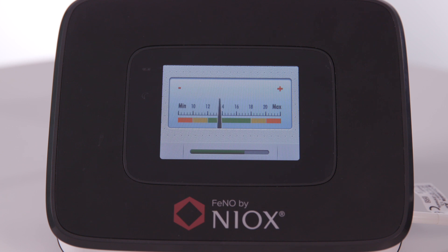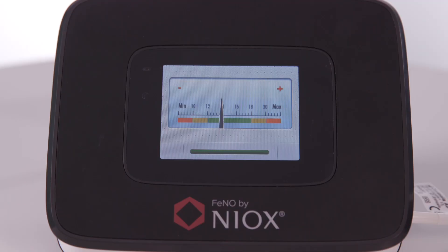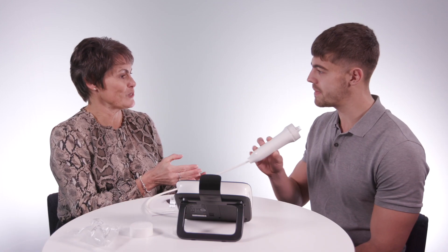That's absolutely perfect. Keep that blowing nice and steadily — we're over halfway now. A couple more seconds. That's absolutely brilliant. Well done.